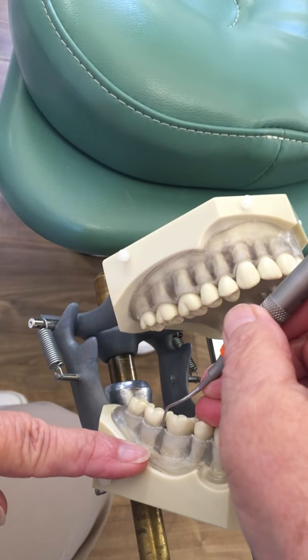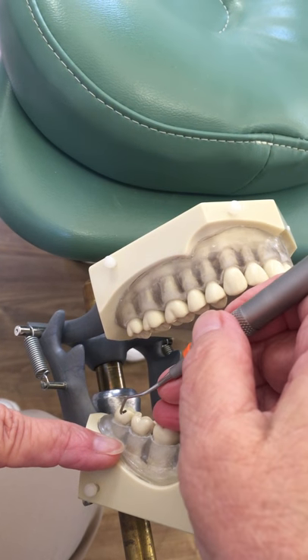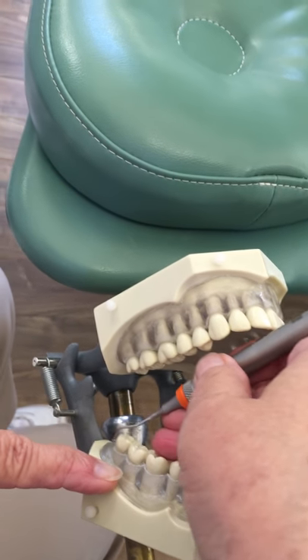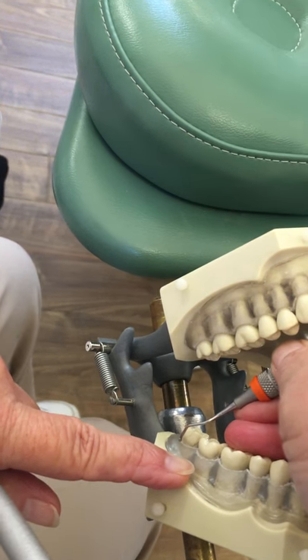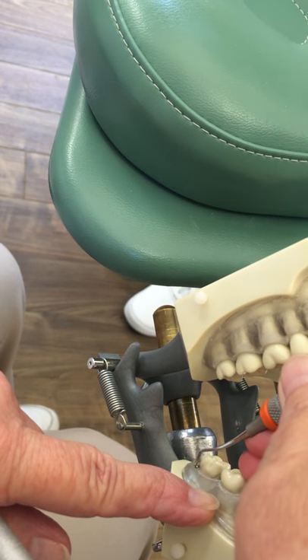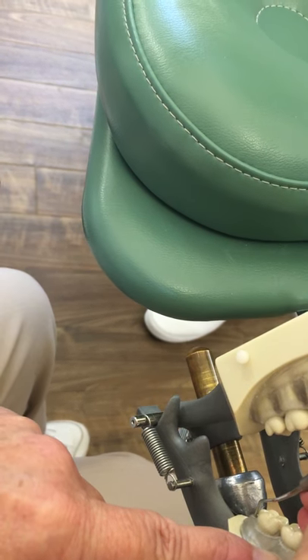It's really obvious when it's wrong with these instruments. So now I'm going to fulcrum on tooth number 30 and extend it slightly in my fingers. I'm going to start at the distal line angle, pull in close to the tooth, and then slightly away. My shank and my handle are on the same side that I'm working on, and I'm going to go around the corner.